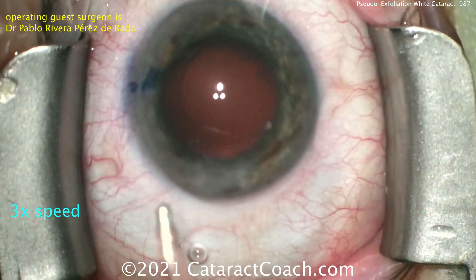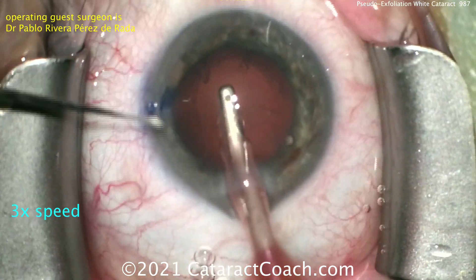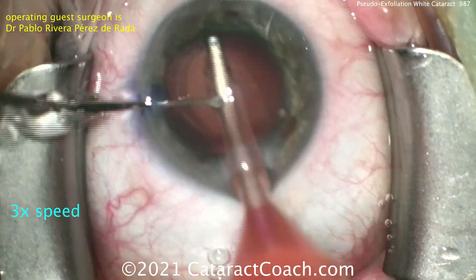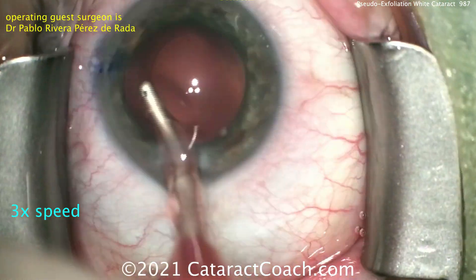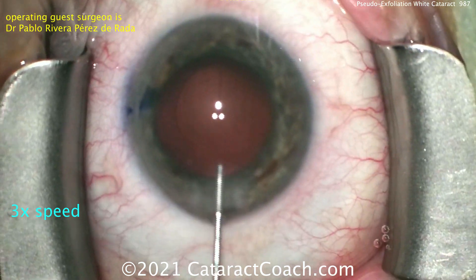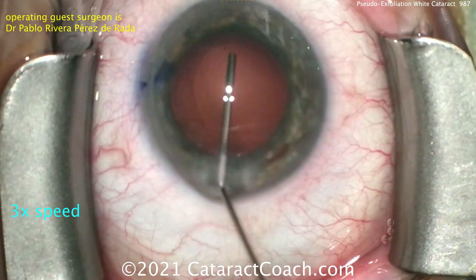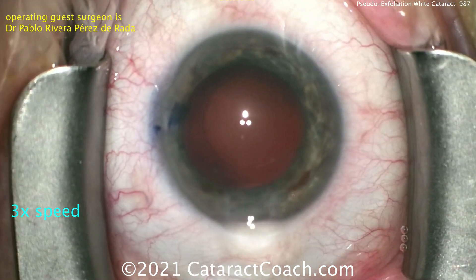Not much cortex remaining in the capsular bag. We're going to remove that and polish up the capsular bag as well. Remember, these pseudoexfoliation patients are more likely to have capsular phimosis in the post-op period — that's where the anterior capsular rim will really phimose down and become smaller and more fibrotic. So cleaning off those epithelial cells from the lens capsular bag is quite helpful.